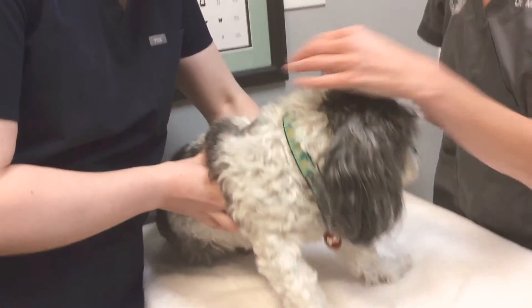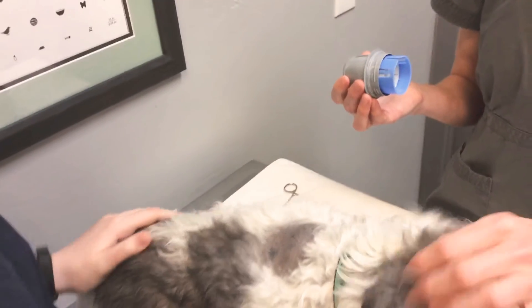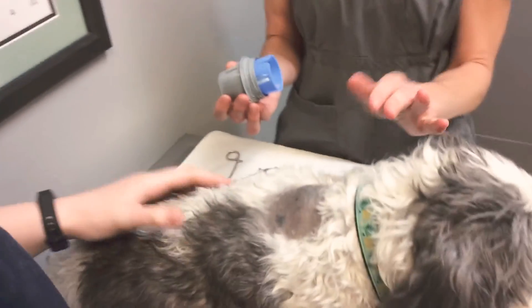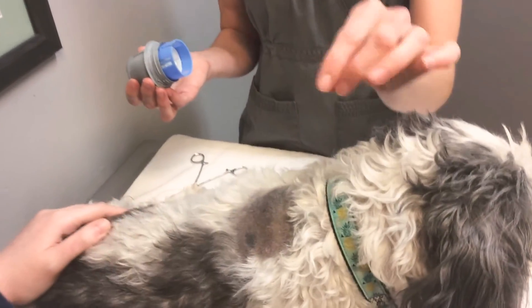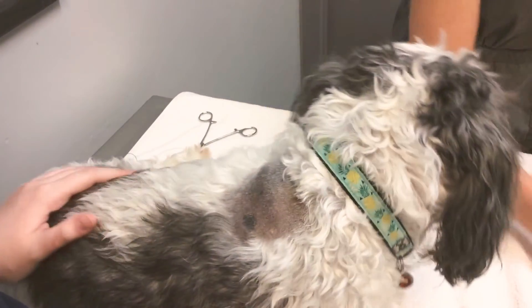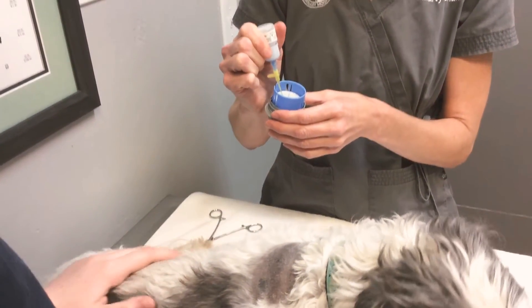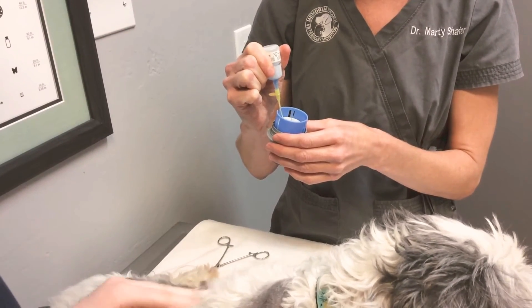Generally in animals, we put the glucometer over their shoulders because it's a hard area for them to access and they don't have a lot of nerves there, so it's more comfortable. This area has already been clipped of fur and I've put a little rubbing alcohol on to dissolve some of the oils so that it's going to have a better sticking mechanism. I'm actually going to put a couple of extra drops of tissue glue on the glucometer, but you don't have to do this at home if you don't have it.